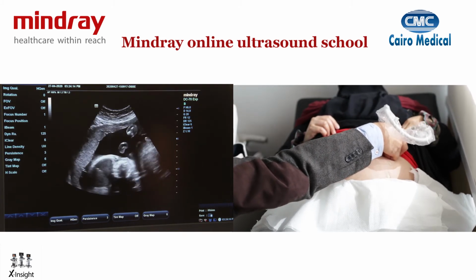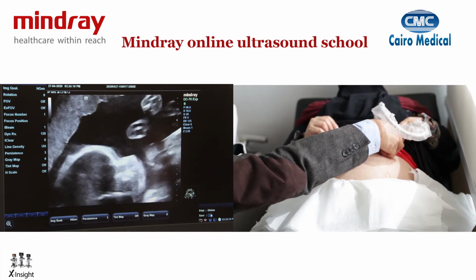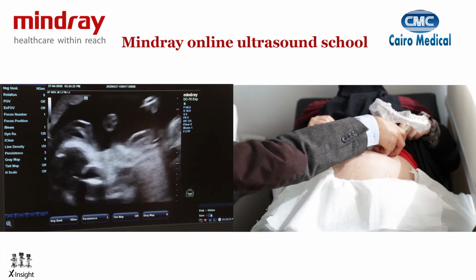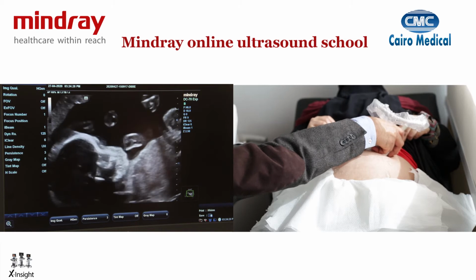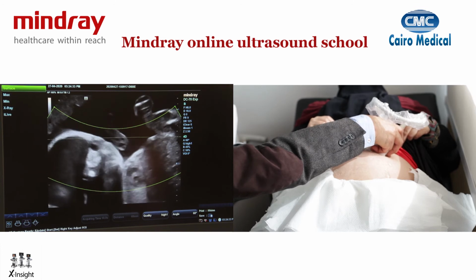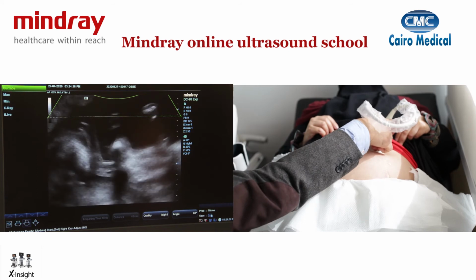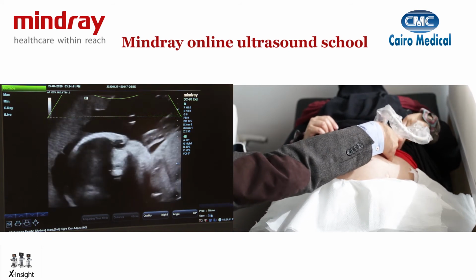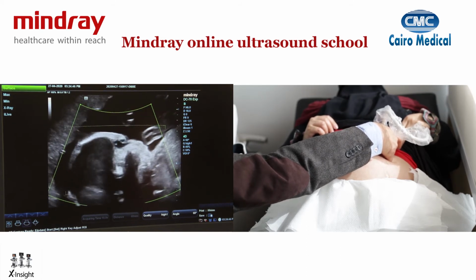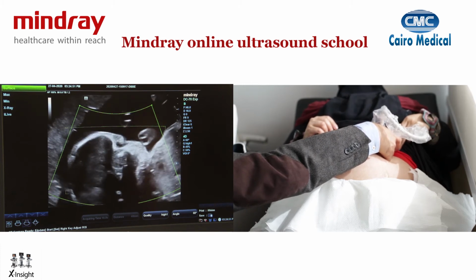I'm going to get it in the middle of the screen. I'm going to try and adjust so that I can get a bit of zoom so it's more in the center. I'm going to reduce my gain so I can get a decent view so it's not too bright or too dark. And then I'm going to put my 4D window on it. And as you can see in the 4D window, we have the camera line, which is this line here. I'm going to get this camera line to be as parallel to the target as possible. And I'm going to reduce the window to take just the object of interest, which is, as you can see here, the fetal face and the profile.